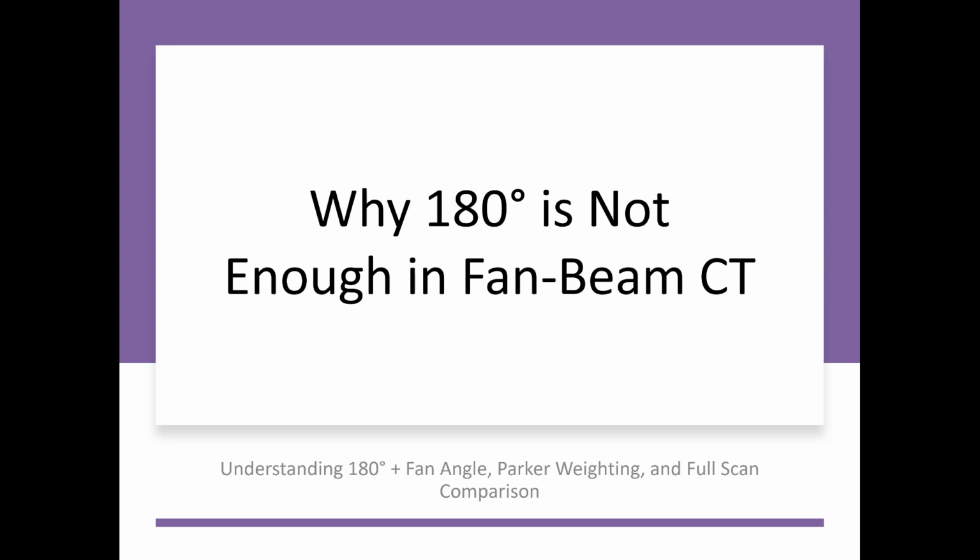And here's the hook. If you've ever worked with cone beam CT in radiation therapy, you'll notice significant reconstruction artifacts if you only acquire 180 degrees. That's exactly due to incomplete data acquisition. And today we'll see why.